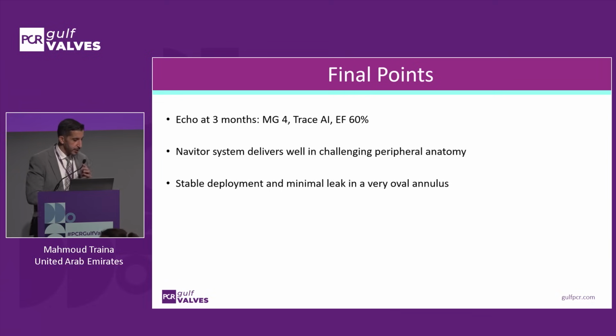So I just want to show this case because it highlights that it can deliver well across challenging peripheral anatomy. It's a very stable deployment, and in a patient with a very oval annulus, it allows you to manage it carefully and closely and then post-dilate with a good result.